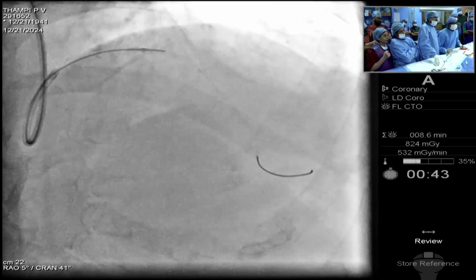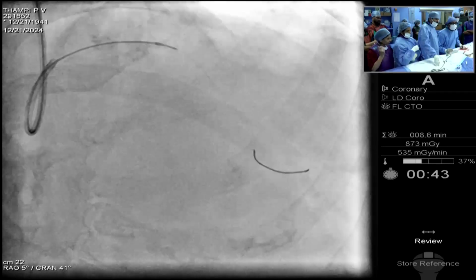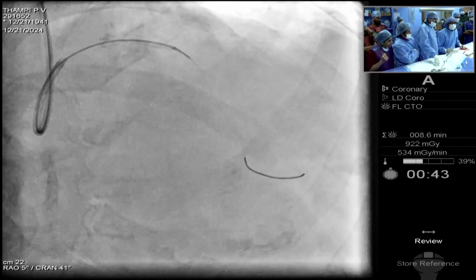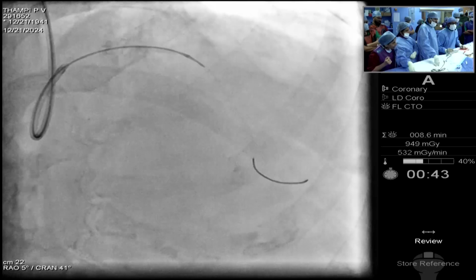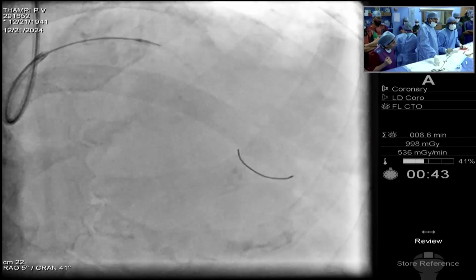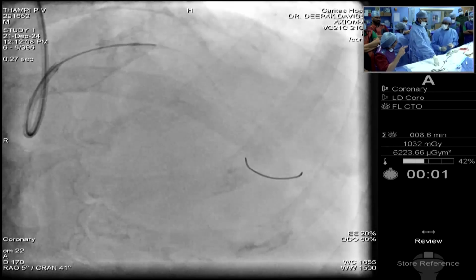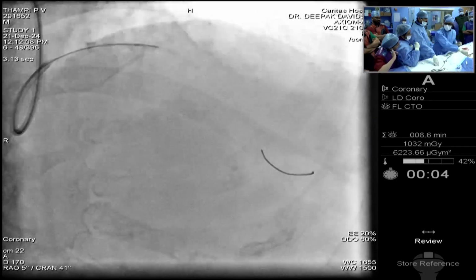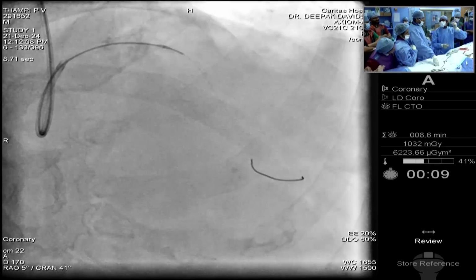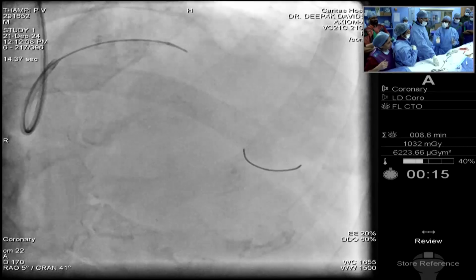That is the area where we see the maximum calcium. You can listen to the pitch. There is a difference in pitch over there. You can also do the retrograde sanding. That is actually difficult to make, but while doing the 25 seconds, you can identify if there is a variation. If there is a difference, you can always identify the difference in the proximal portion and the distal portion.